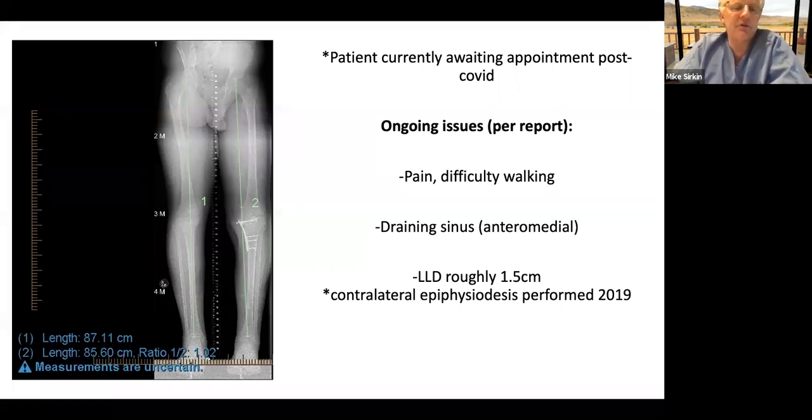You can put the cement in a doughy form. And if you do that, what you want to do is continuously irrigate that cement so that it never gets too hot and burns the bone. And then if you need it as a stabilizer, it actually becomes just like part of the bone, so that you're able to have stability from your cement spacer.